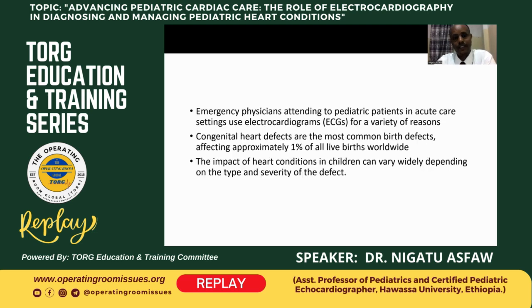Emergency physicians and all clinicians use ECG for a variety of reasons, including monitoring of critical patients in real time, so that problems in cardiac rhythm and heart rate can be picked up early and intervention can be done earlier, which can improve prognosis in overall patient care and outcome.